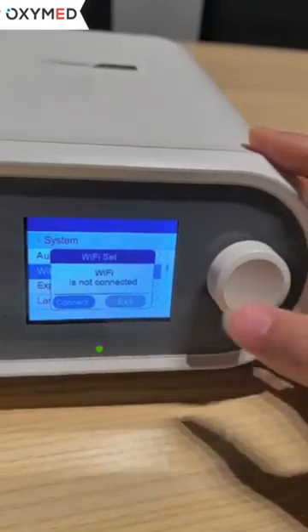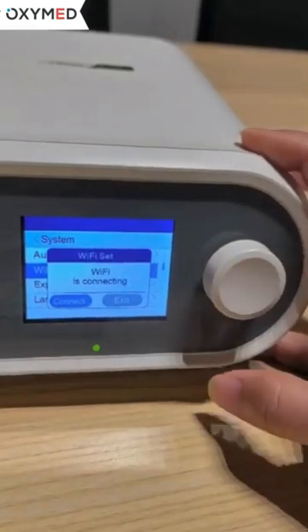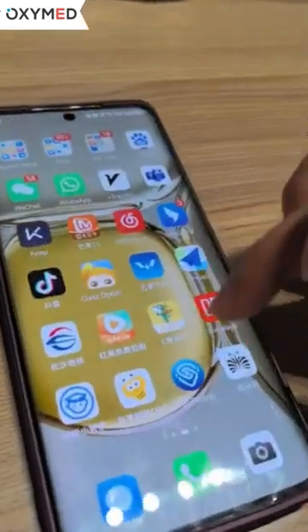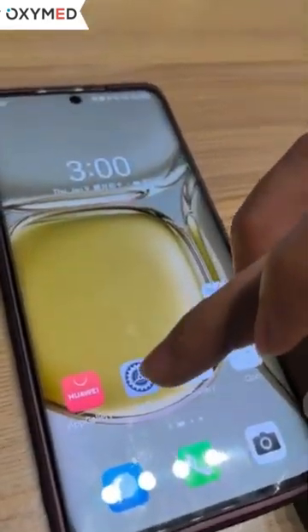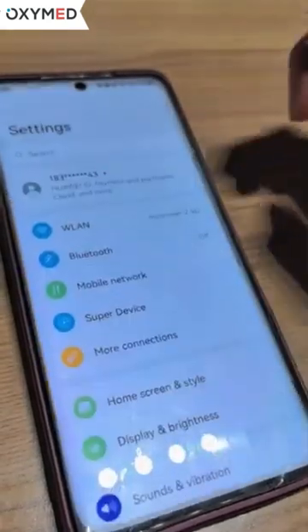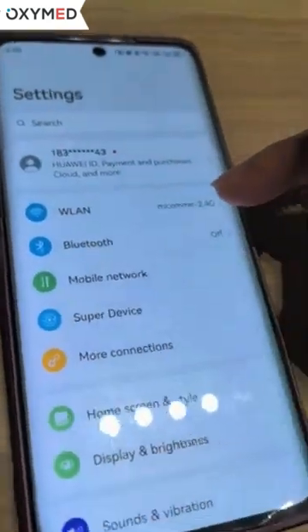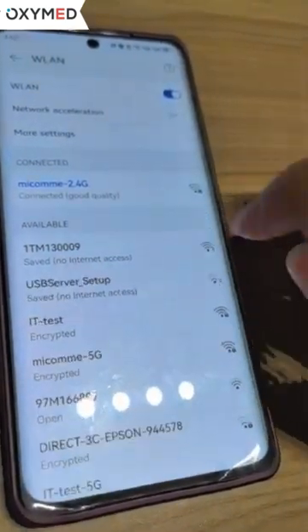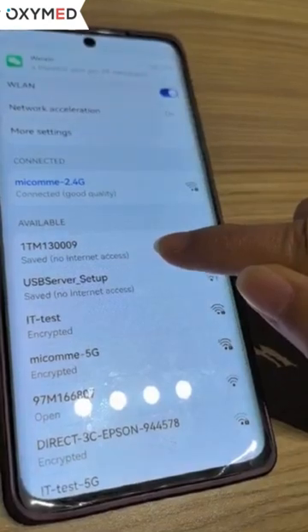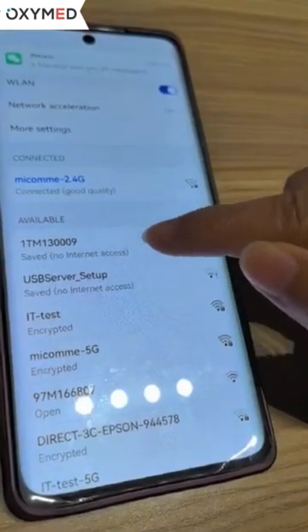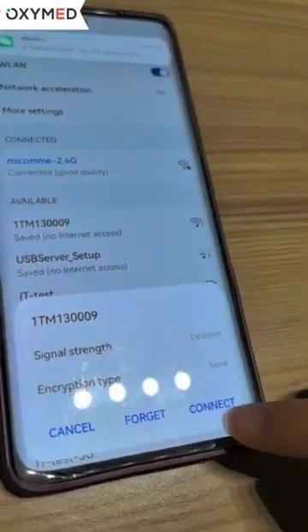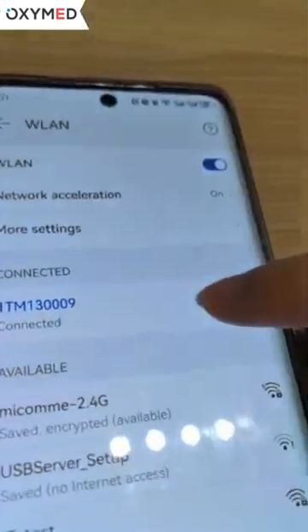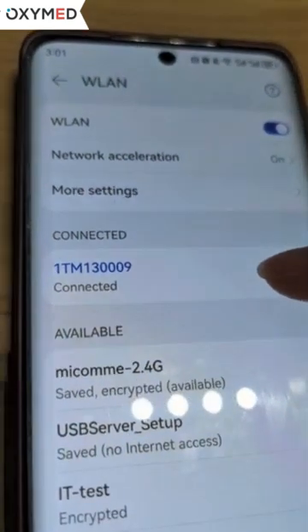We press it and the display will show 'Wi-Fi is not connected'. We then select connect, and the display will show 'Wi-Fi is connecting'. Next, we go to our mobile phone settings, enter Wi-Fi manually, find the device number Wi-Fi, and choose connect until it shows the Wi-Fi is successfully connected.